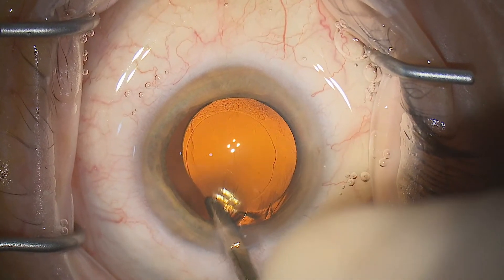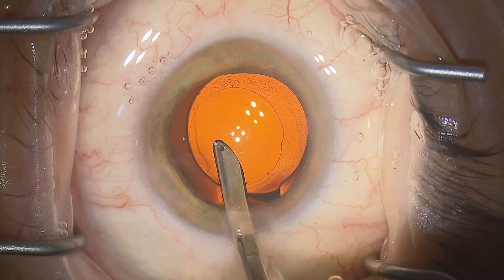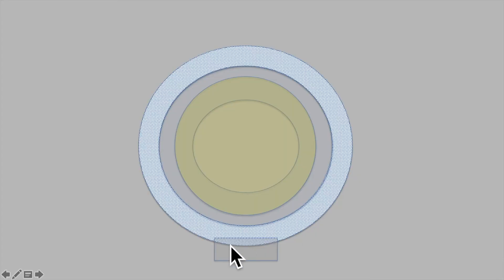Let's finish with a very important point about how you get under the lens with the IA cannula. Take a really good look at the starting position of the IA cannula here inside the rhexis. Let's look at this schematically with the main entry site here, the iris shown here, the lens optic edge here in the capsular bag, and the rhexis edge here.